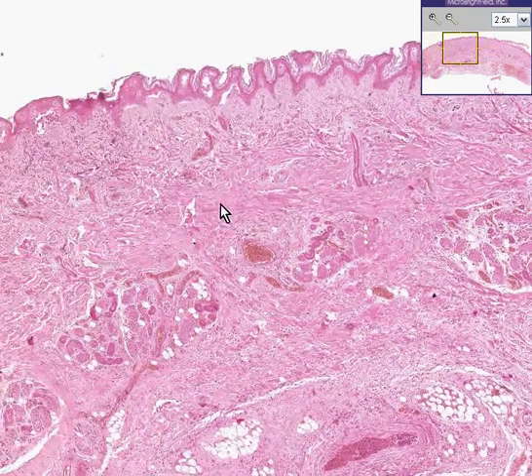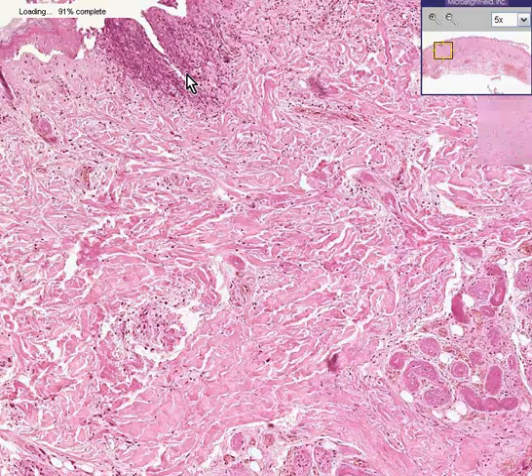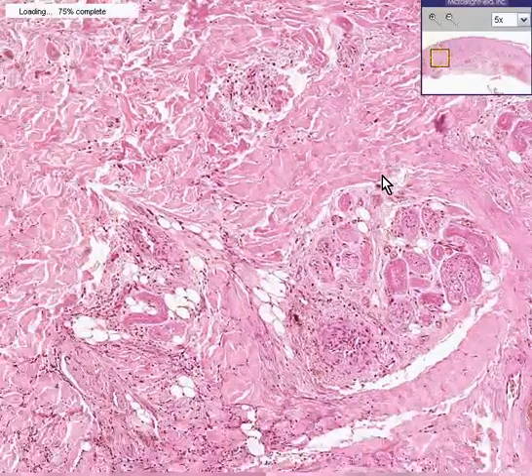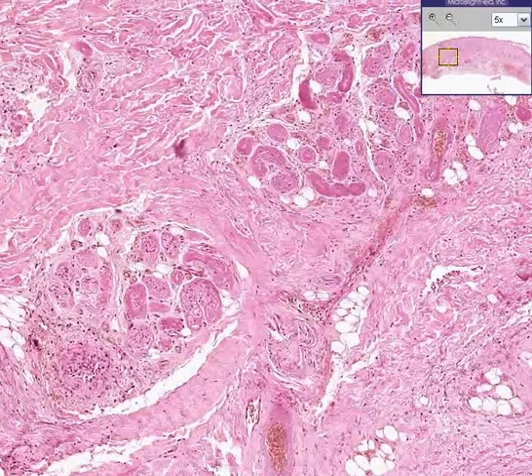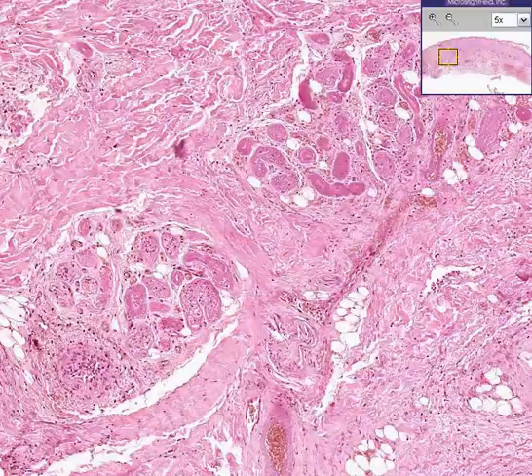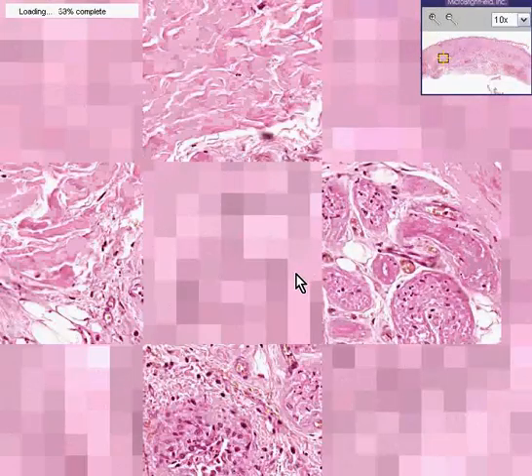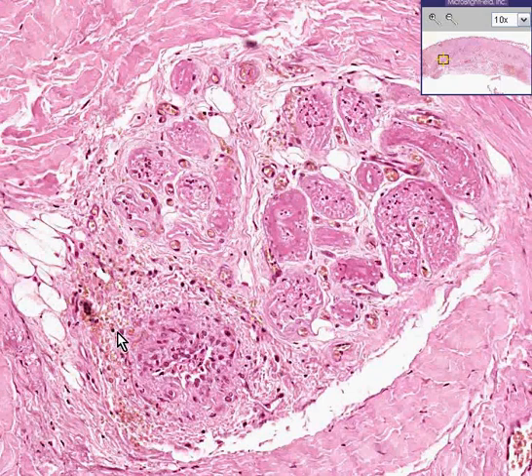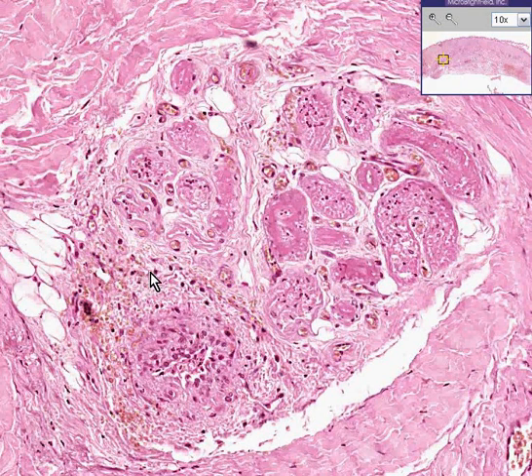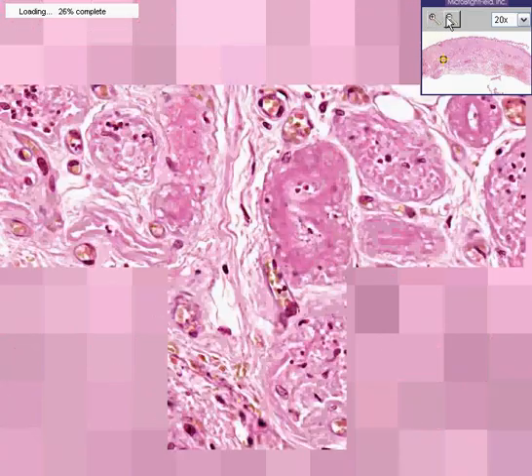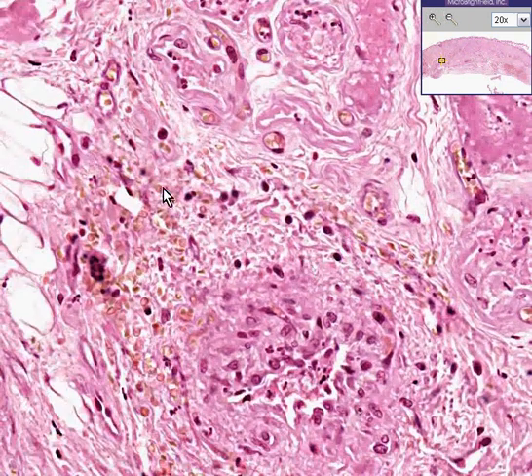Doesn't look terribly bad so far, does it? Oh, we can see an area here, for example, that looks like it is infiltrated by some kind of inflammatory cell. And we can also recognize that if we go to an area like here — a sweat gland, which is nicely labeled for us — we can see that you can't recognize cellular detail too much. There appears to be some granularity, coagulative necrosis, perhaps some hyalinization over here, and hyalinized tissue here, some granularity within the cytoplasm here. Hard to make out outlines of cells in many areas.